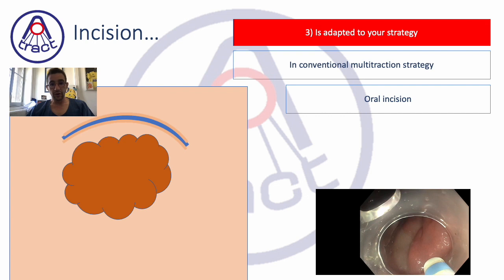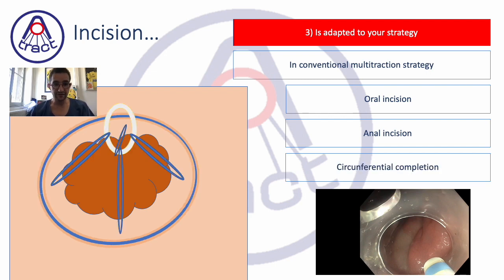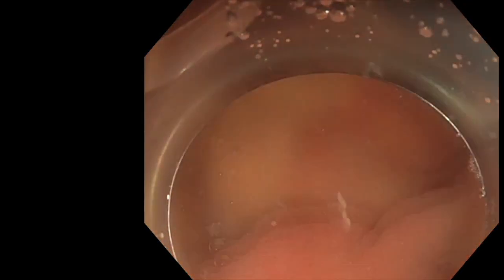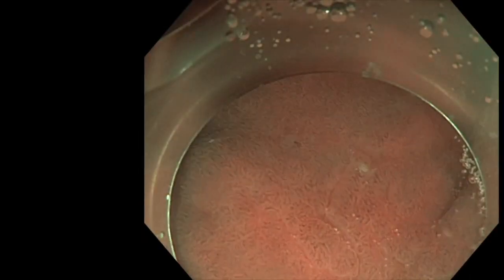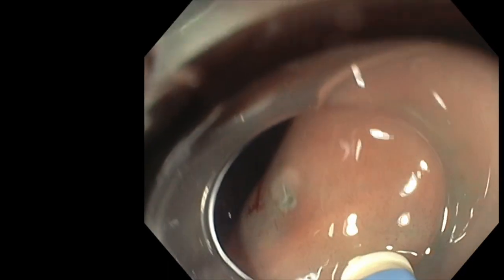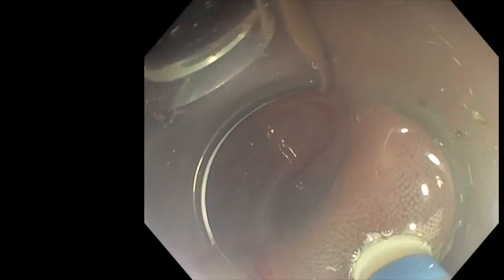The incision should be adapted to your strategy. When you use a conventional multi-traction strategy, you should do the oral incision first because it helps to start, then the anal incision, then the two sides, and then the multi-traction strategy will be placed. Here is an example of such an incision — a non-granular LST with two different components in the upper rectum, quite difficult to see. We do the incision circumferentially, beginning here and adapting ourselves to the axis of the device.